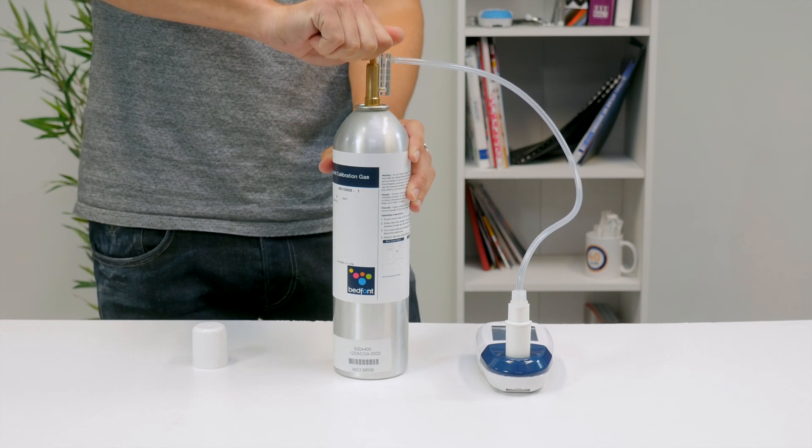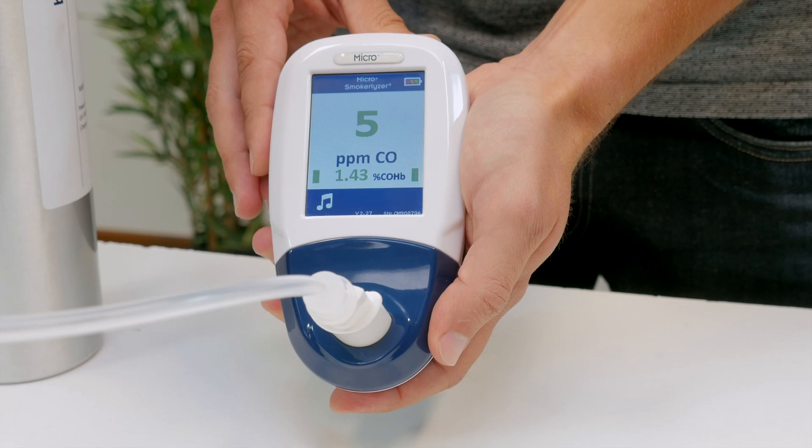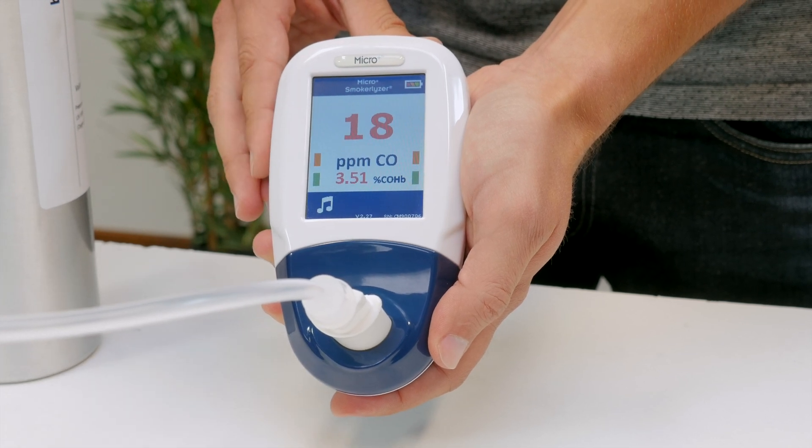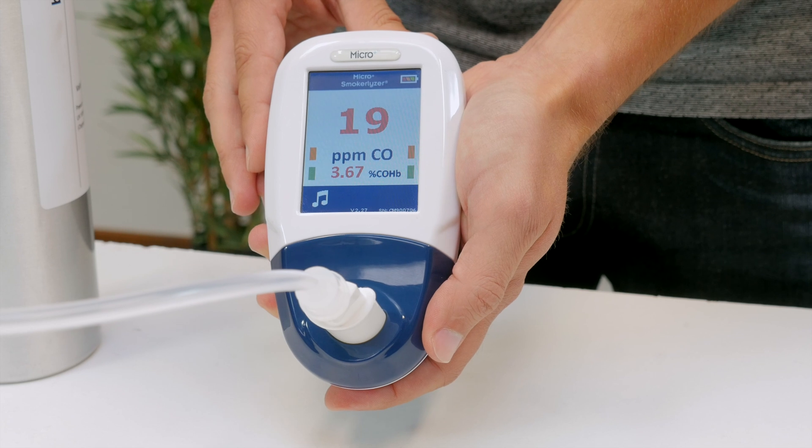Allow the gas to flow through the instrument for the duration of the test. The reading will rise and stabilise on screen. After the test has finished, close the regulator and remove the gas.